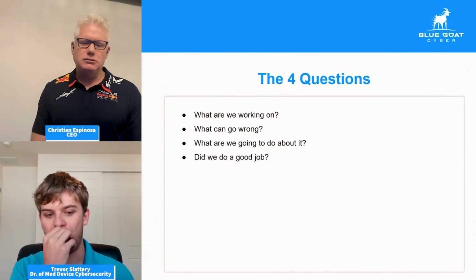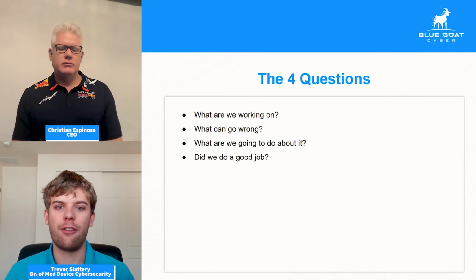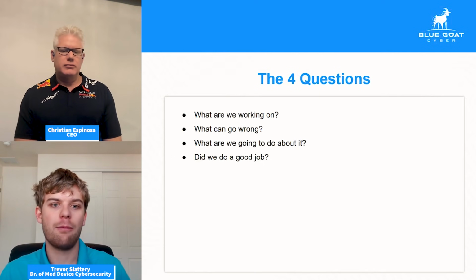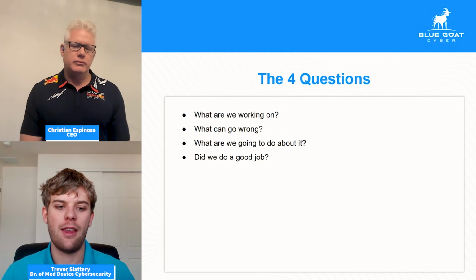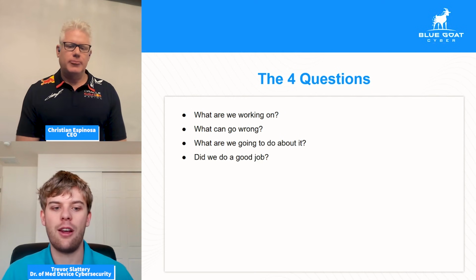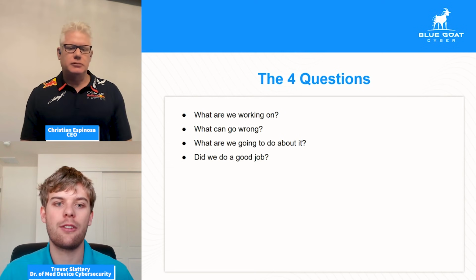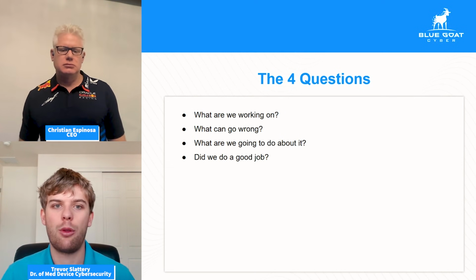All right. So, as per MITRE playbook for threat modeling medical devices, there are 4 big questions that we have to ask. And a lot of this is already covered by some of the things that we've looked at. So, the first being, what are we working on? That's usually going to be the threat diagramming process. We're trying to understand the device, what it is, what it's doing, how can we best represent the product.